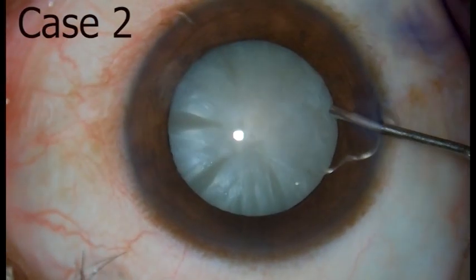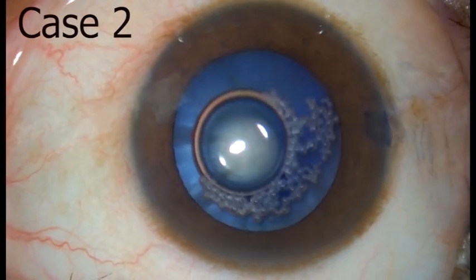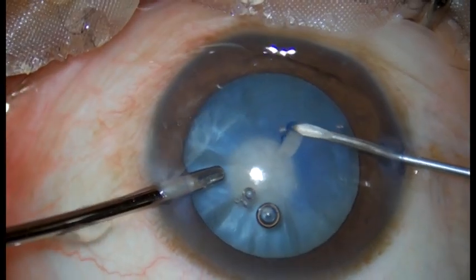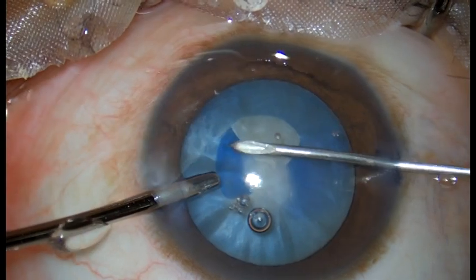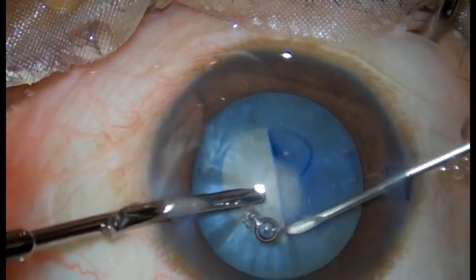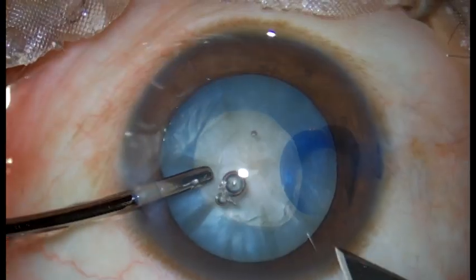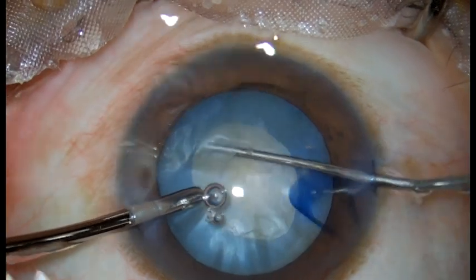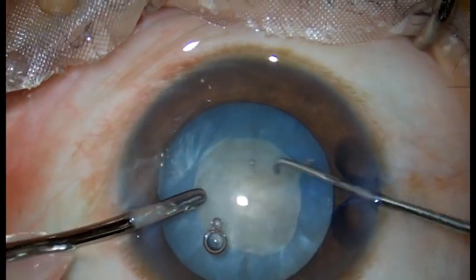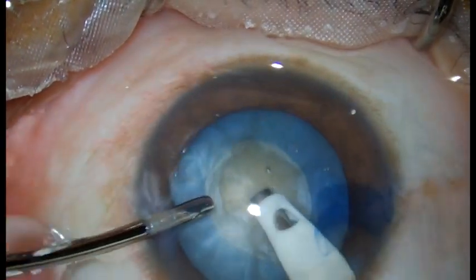Viscoelastic itself has its own problems intraoperatively and postoperatively. Intraoperatively, it can cause post-occlusion surge, which can happen during sculpting if high viscosity OVDs are not removed before. Another problem could be wound burn in hard cataract, where fluid space is necessary around the phaco tip.